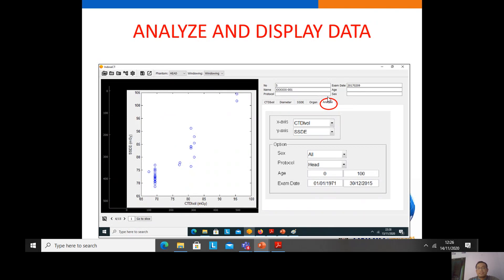If we want to analyze the data, we click this button. After clicking, we have many options for setting the x-axis — for example, CTDIvol or other metrics — and the y-axis — for example, SSDE and other metrics. We can also choose the sex, protocol, and patient group, and then we get the resulting graph. The x-axis is CTDIvol and y-axis is SSDE, so we can see the trend of the data of our patients using the CT survey.